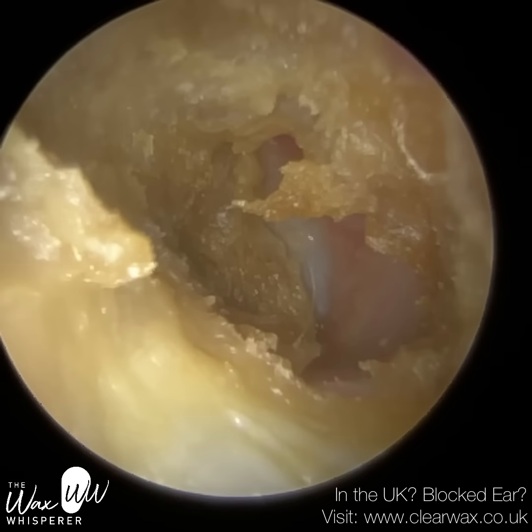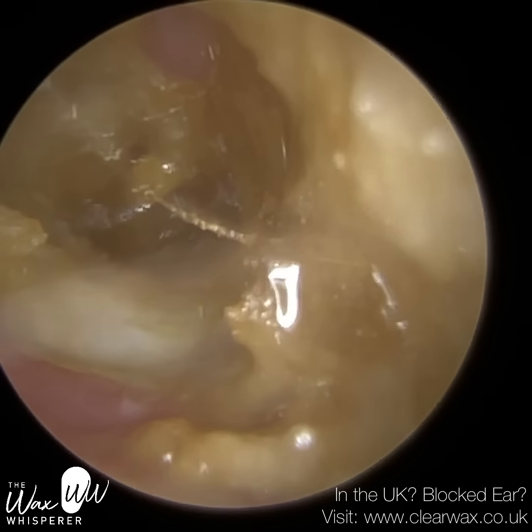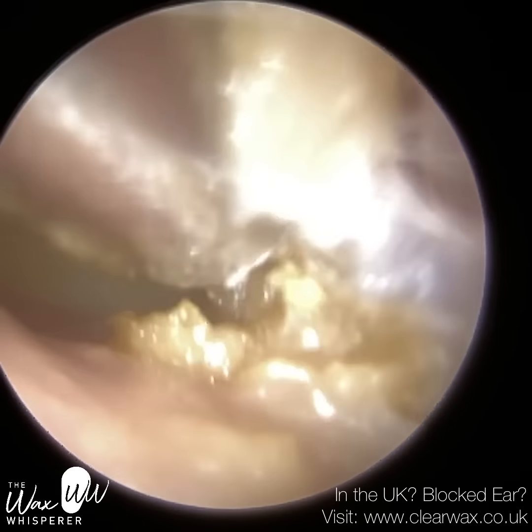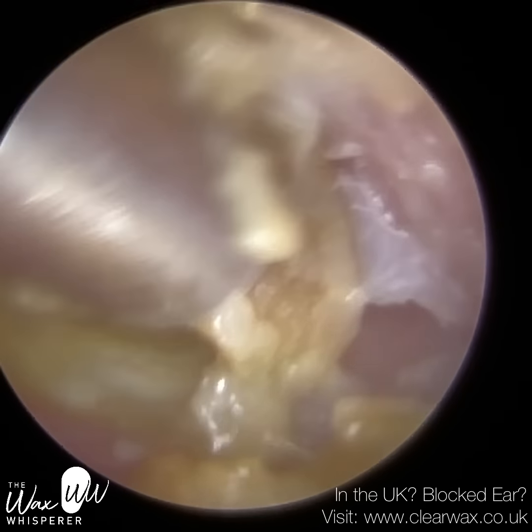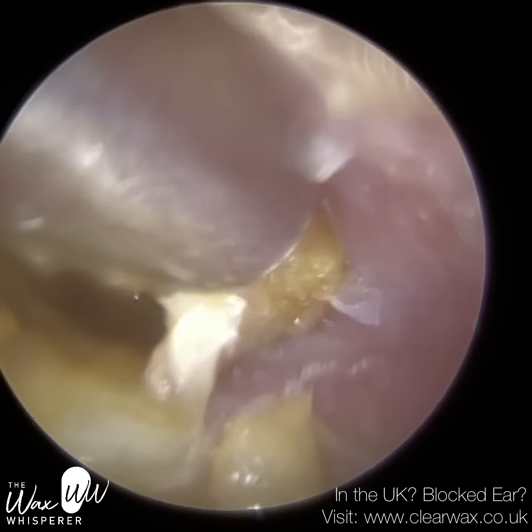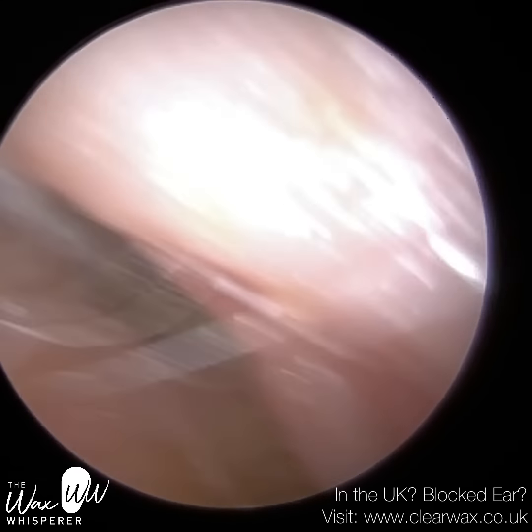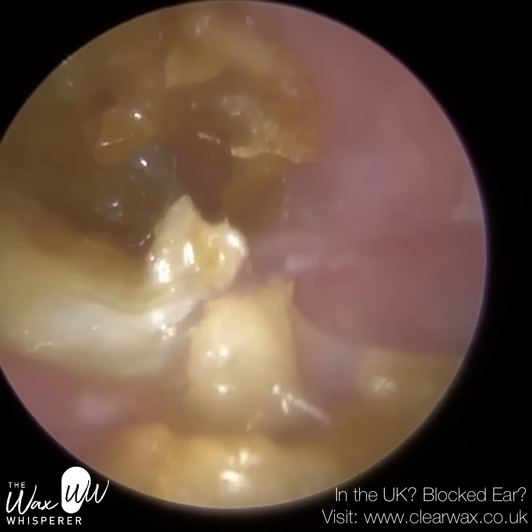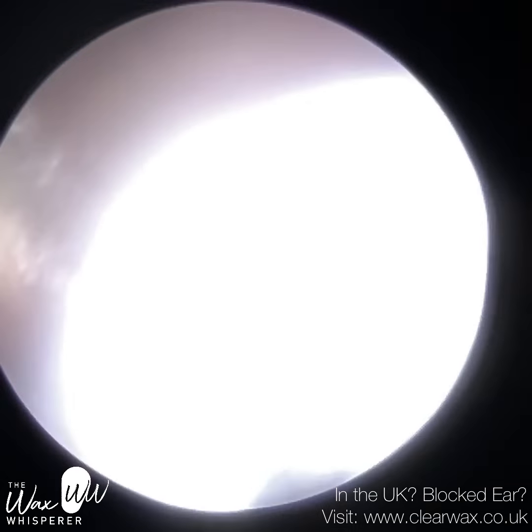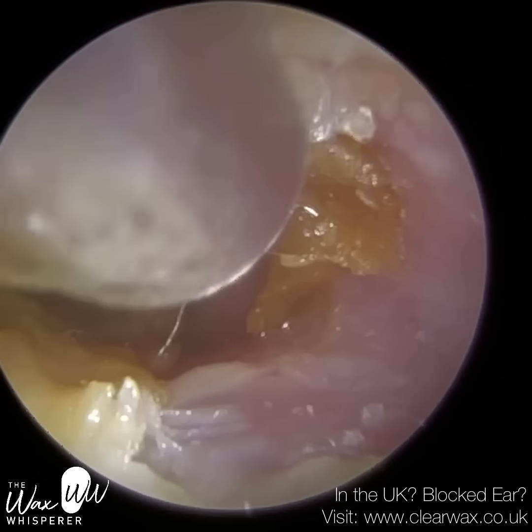For that reason, when entering the ear, I had to stretch the patient's ear open. The endoscope is being held in my left hand, my non-dominant hand, and the instrument is being held in my dominant right hand. Before I insert the endoscope, I'm actually holding the instrument in my right hand, but simultaneously I'm pulling the ear back and up. The pinna — which is the flap of cartilage on the outside part of our ears protruding out on the side of our heads — by pulling it back, it stretches the ear open, and by pulling it up, it then levels the ear canal.